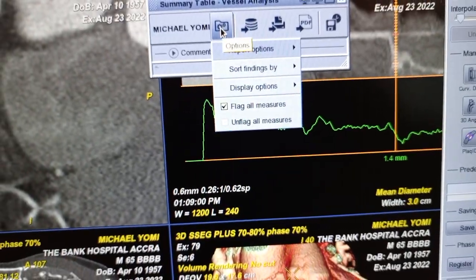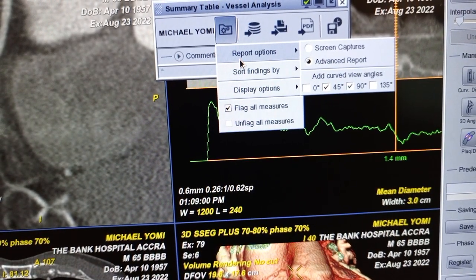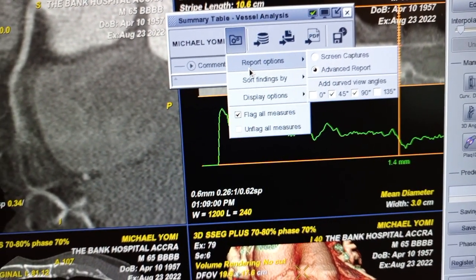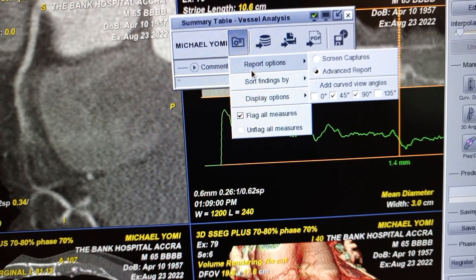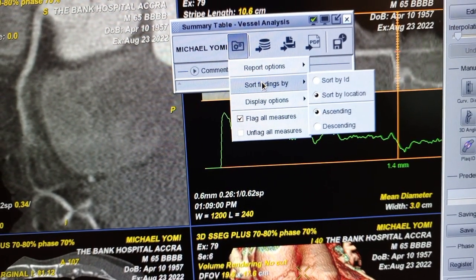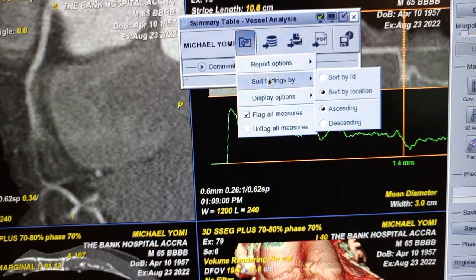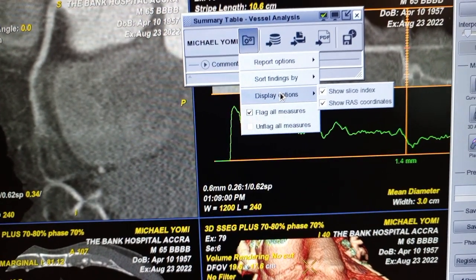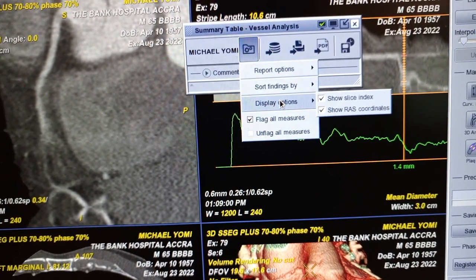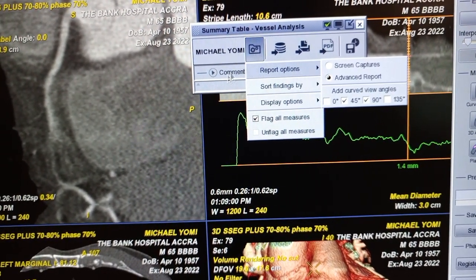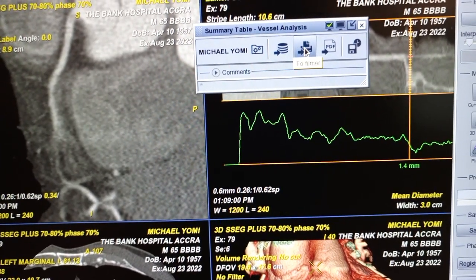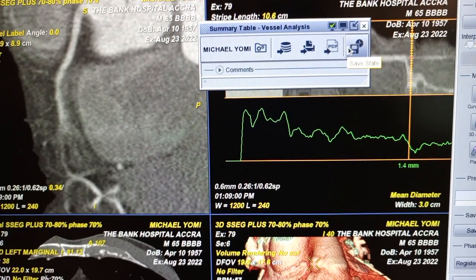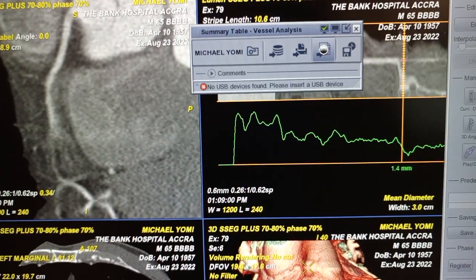You have options — within the options, you have the advanced report. For each vessel, you can set the angle from 45 to 90 degrees to see the vessel, then sort by location. We also have show slice and show coordinates. Once everything is set, you can export to PDF or save. Let's export to PDF.